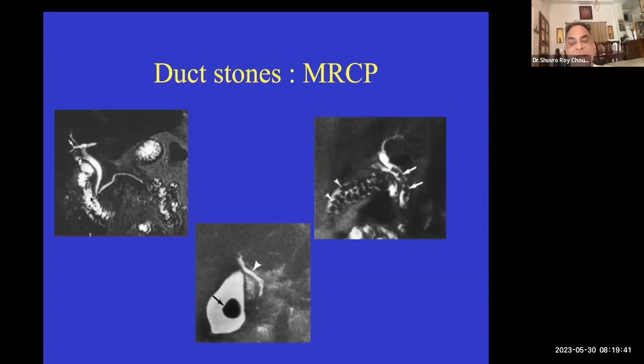And there is another thing about technique I would like to talk to you about, which is something called secretin induced MR pancreaticography. Secretin is a hormone that can be injected so that there is active excretion from the pancreatic duct. So if you wanted good pancreatic duct visualization, you could do secretin induced MRCP, and that will show you the pancreatic duct very well.